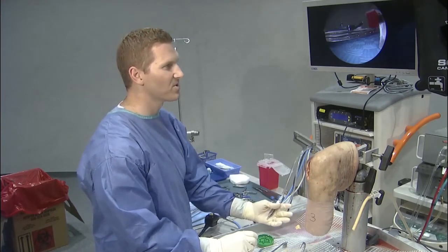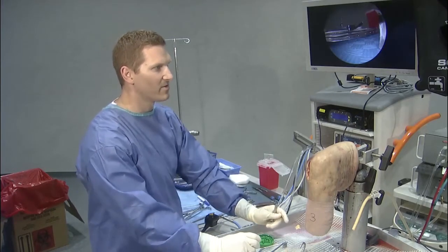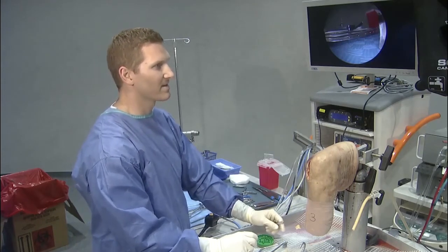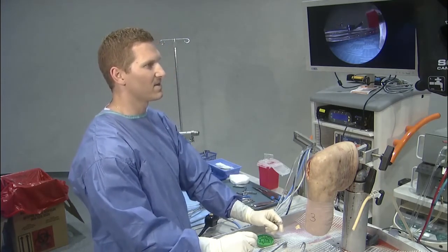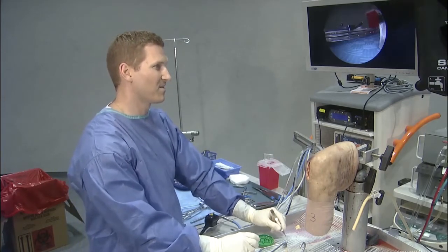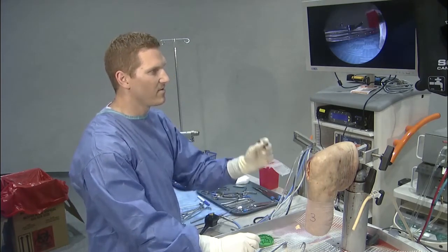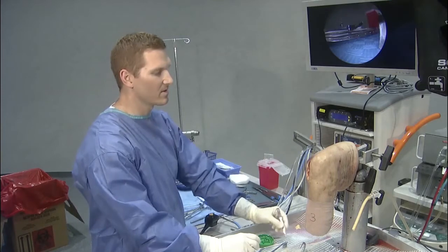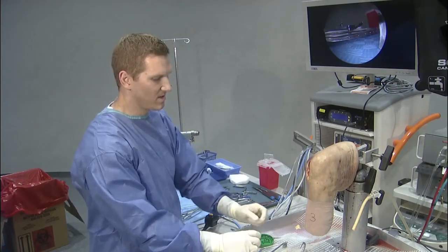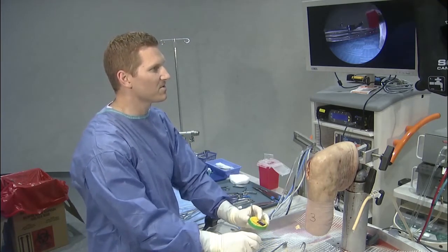Yes, I guess in general, what I would recommend is that you're just not taking many biopsies as just-in-case treatments. I think if you're moving forward with the biopsy, you should really have this as a potential treatment in mind. So that starts when I meet the patient in clinic. Unfortunately, if I see a candidate for this MACI technology, the first thing I'm doing is checking their insurance information. Often the major insurance carriers will have in their policy specific guidelines, and typically we aren't able to seek insurance approval until we do the biopsy and the cells are in lab.